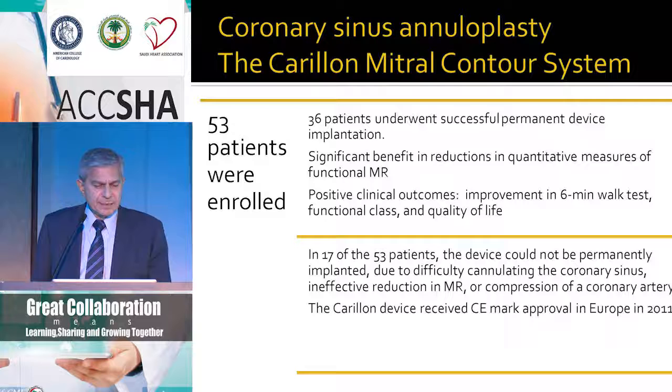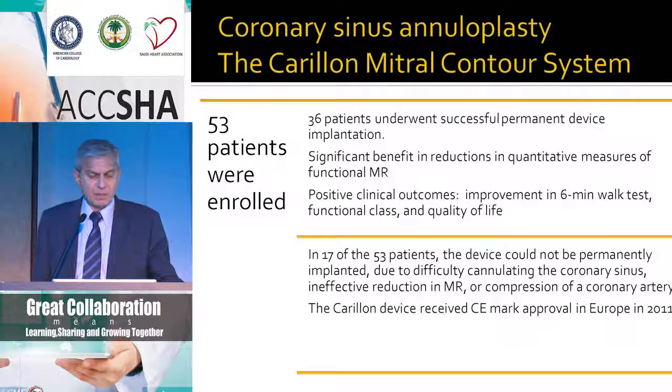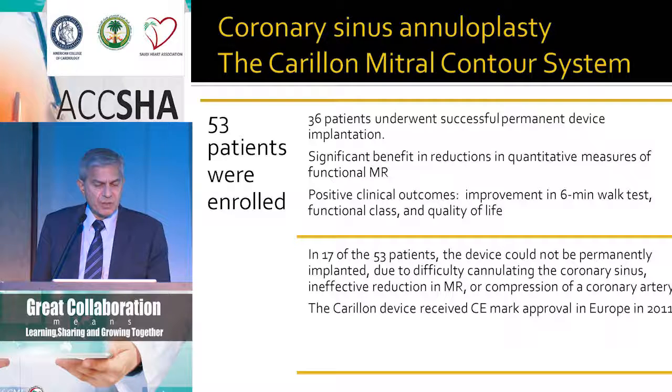This was a study on the Carillon mitral contour system, which already has obtained CE mark approval in Europe in 2011. 53 patients were enrolled, only 36 were successful, and in 17, the device could not be permanently implanted due to some difficulties or compression of the coronary artery. Remember the circumflex artery.